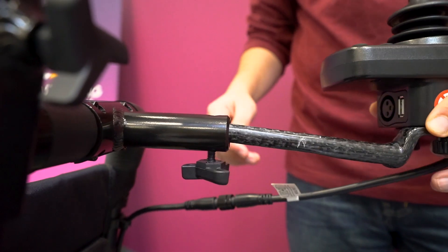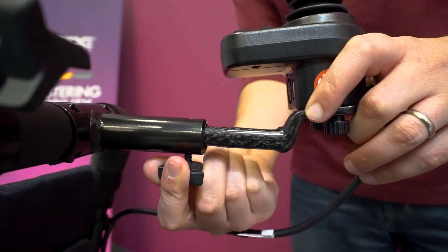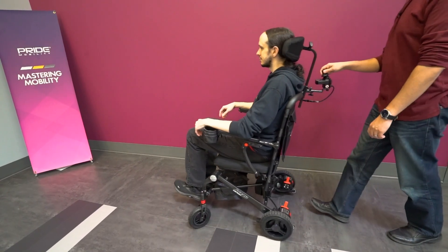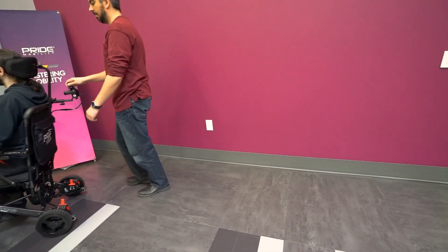Second, you can add a mounting bracket on the back of the chair for an attendant control. The joystick can be removed from the arm and secured in this position, so that if necessary, a caregiver may drive the unit from behind.